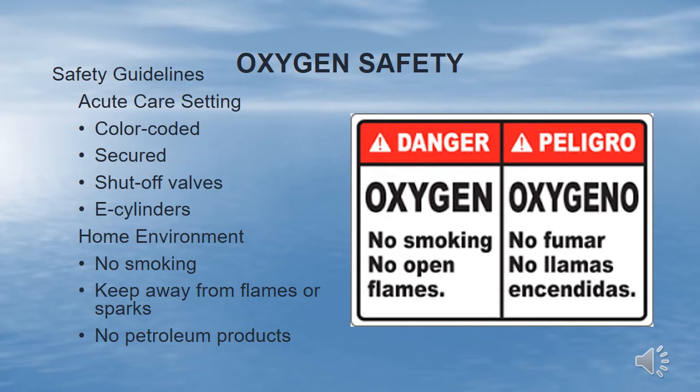Medical air is similar in composition to room air but has no contaminants or oils. It is used for some respiratory therapies and ventilators and is denoted by the color yellow. Oxygen and medical gases have emergency shutoff valves on the wall at various zones throughout the hospital. Nurses should know the location of these valves. The nurse should also be knowledgeable about who is designated to turn off the supply to a specific zone in the event of a fire. This action will affect all patients in that zone and is pre-assigned as part of a hospital fire safety plan, typically to a nurse manager.